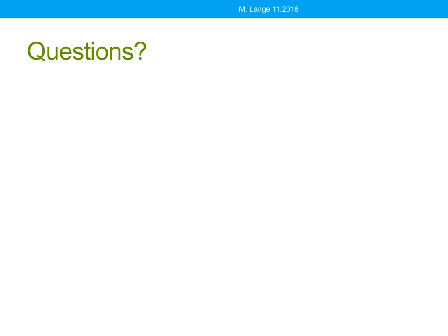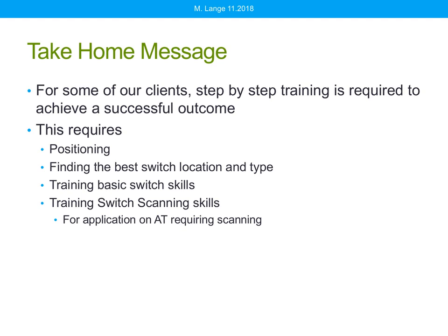So I would say that making the decision to stay with one switch versus two is going to depend partly on vision and a good part on whether your client has the motor capacity to hit a switch hundreds of times a day. And Elizabeth has mentioned fewer switches, fewer things to set up and lose. Good point too. All right, we have another question, and I will get to that.